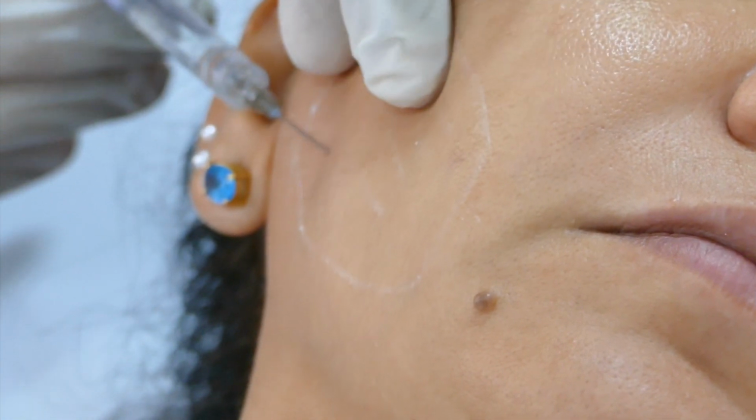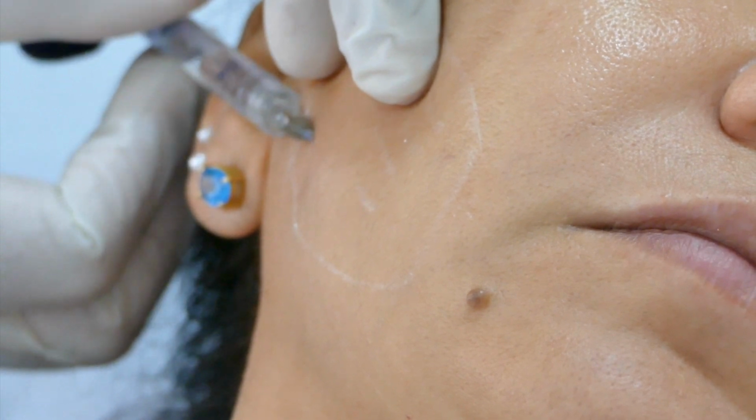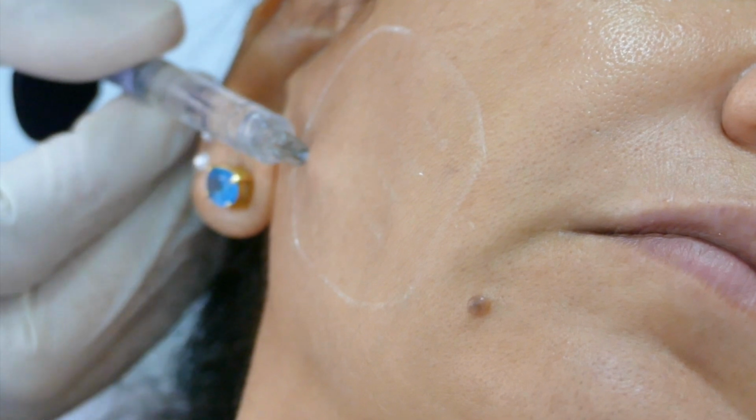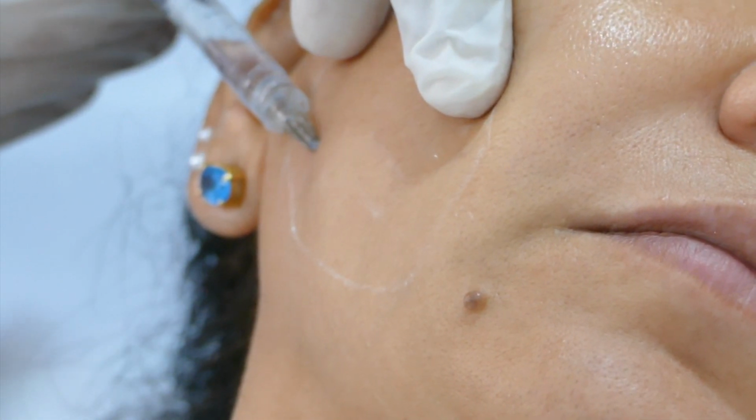You can see this is superficial. You can gently glide in, just like this. So this is very superficial, and then I'm going to inject in a radial fashion.